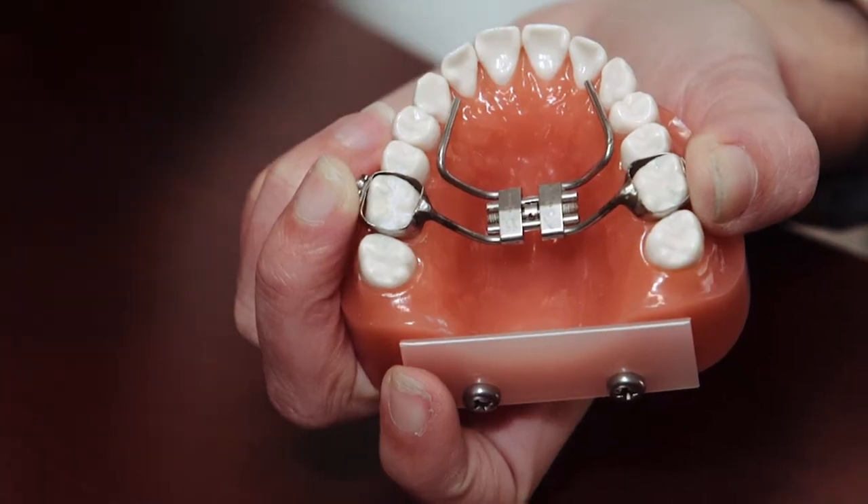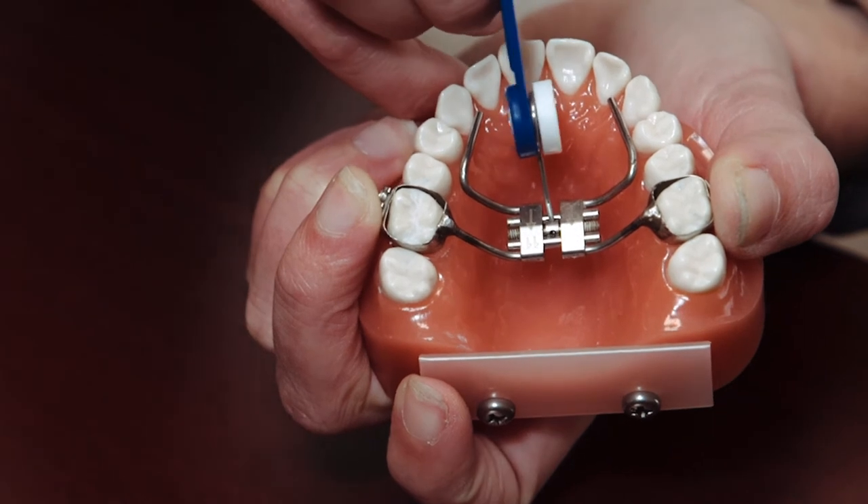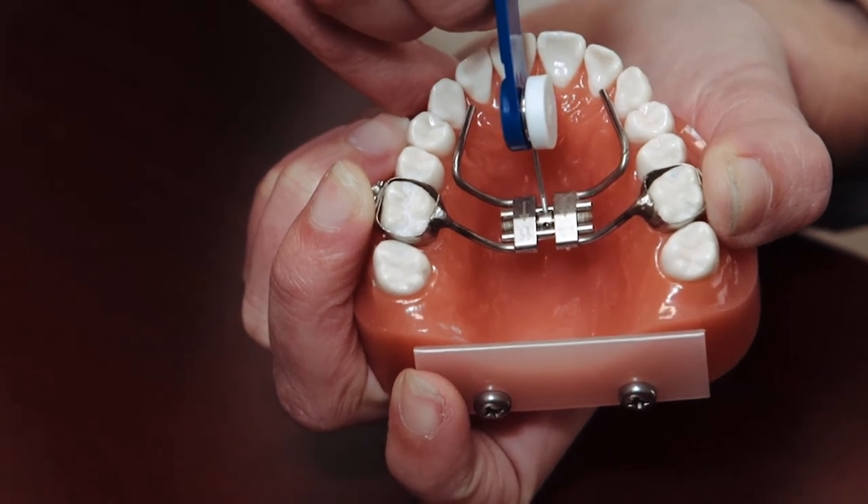You'll tip the patient's head back and make sure you have good lighting — maybe have them hold a flashlight or an iPhone so that you can see clearly inside the mouth. Then you will take the key and insert it into the tiny hole that you see. When it bottoms out you'll feel it at that little dent we showed you earlier.